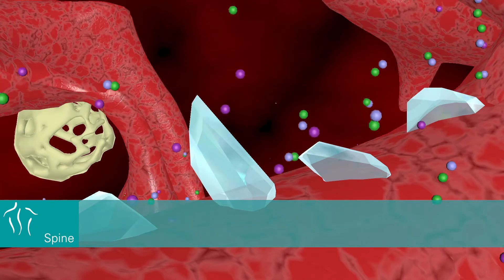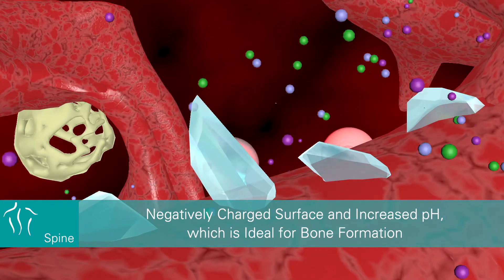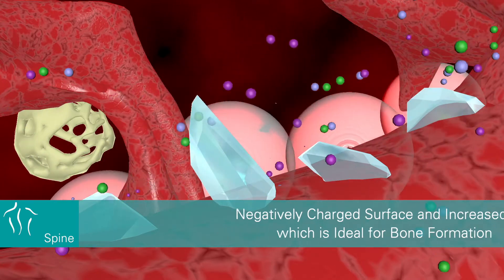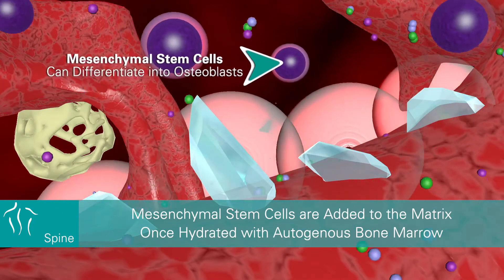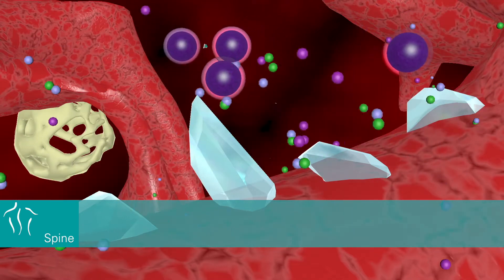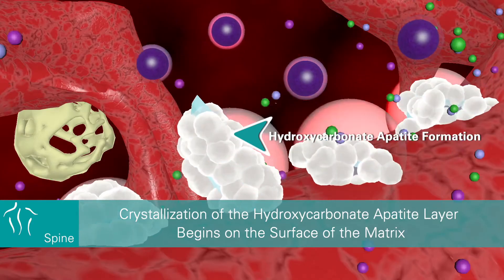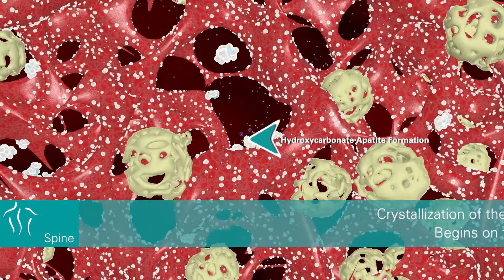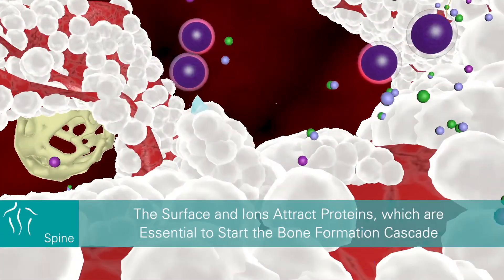This produces a more consistent rate of bone formation, resulting in a negatively charged surface and increased pH, which is ideal for bone formation. Mesenchymal stem cells, which can differentiate into osteoblasts, are added to the matrix once hydrated with autogenous bone marrow. As the bioactive glass resorbs, the crystallization of the hydroxycarbonate apatite layer begins on the surface of the matrix.